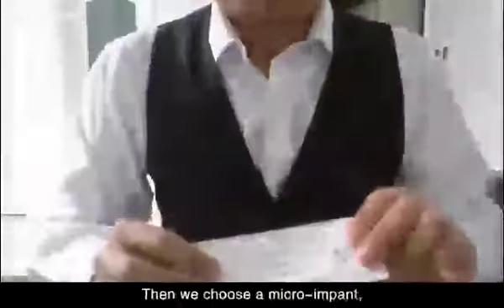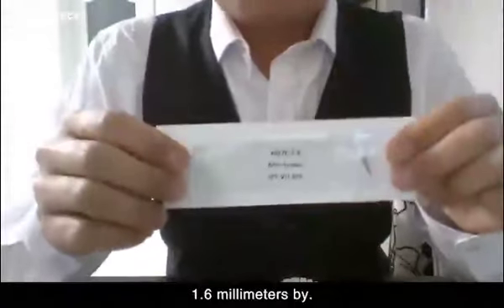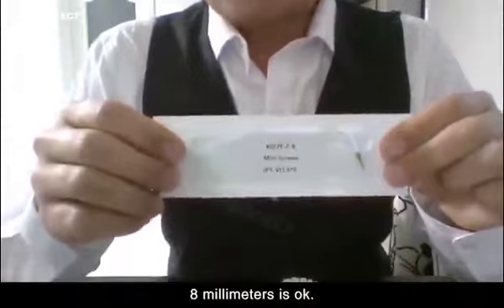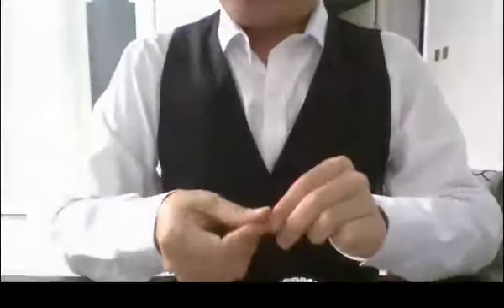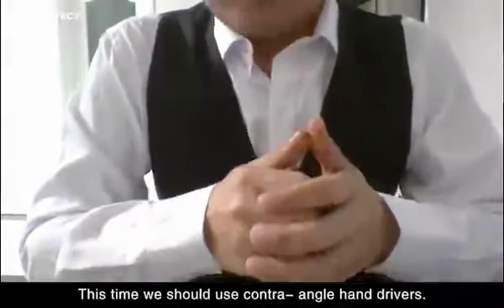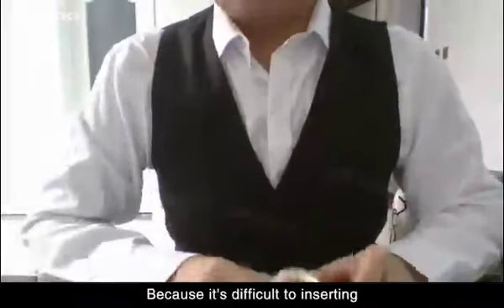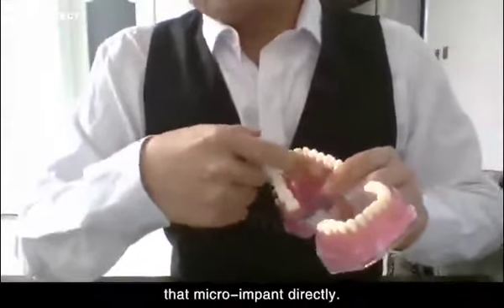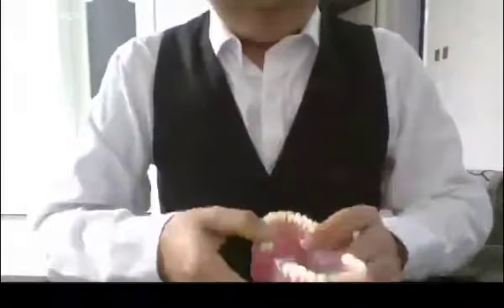Then we choose a micro-implant. 1.6 millimeters by 8 millimeters is okay. This time we should use a contra-angle hand driver because it's difficult to insert the micro-implant directly.